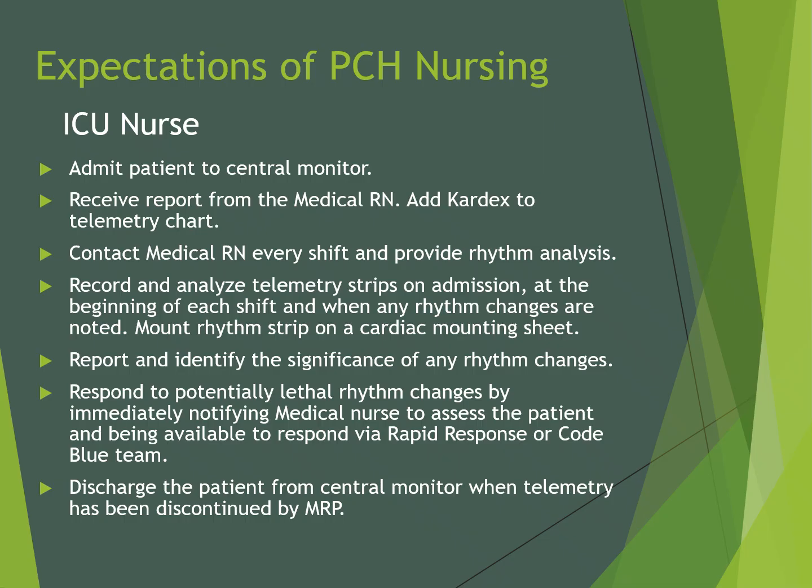The ICU nurse will report and identify the significance of any rhythm changes and respond to potentially lethal rhythm changes by immediately notifying the medical nurse to go assess the patient, and the ICU nurse will be available to respond via rapid response or code blue if the situation requires. The ICU nurse will discharge the patient from the central monitor when telemetry has been discontinued by the MRP.